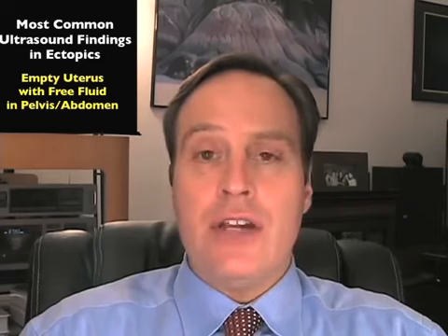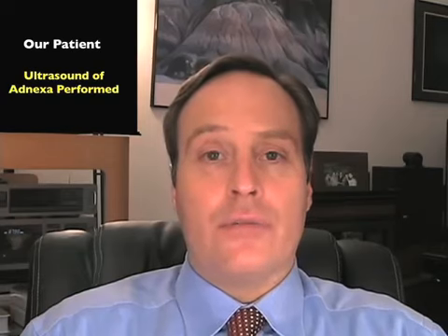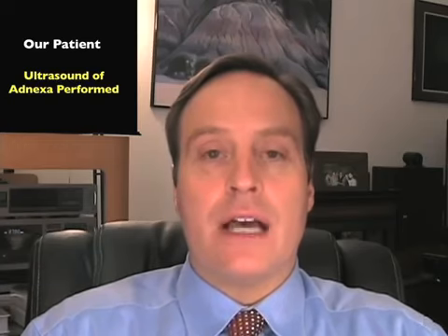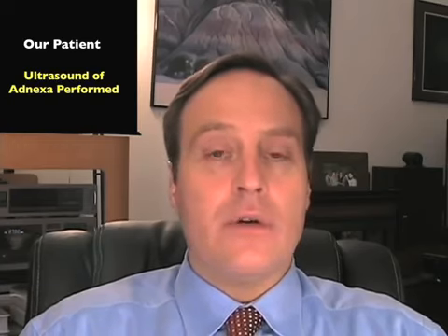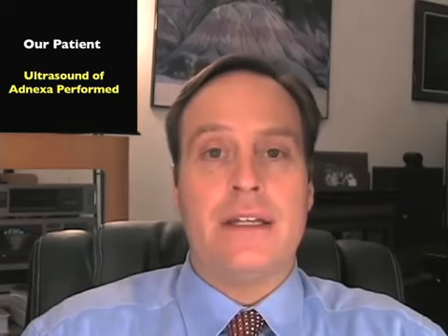So given our patient's very high beta-HCG and the lack of an intrauterine pregnancy, we decided to actually examine her tubes for the presence of ectopic pregnancy. So let's go over the actual transvaginal ultrasound images of the tube that we obtained in this case.